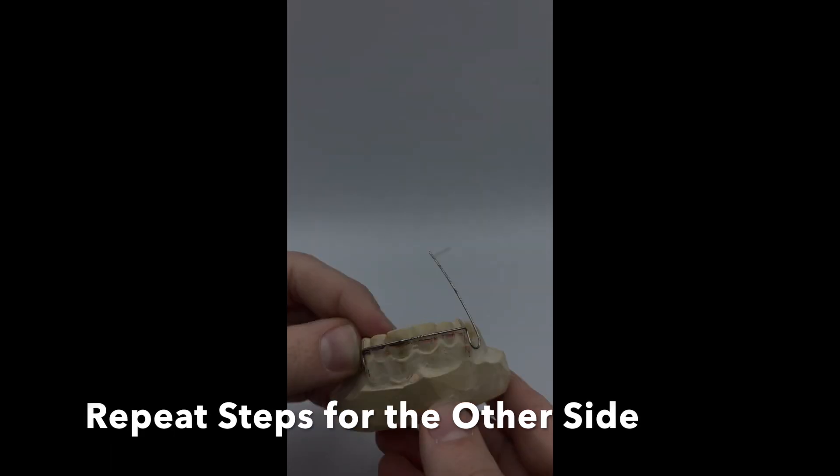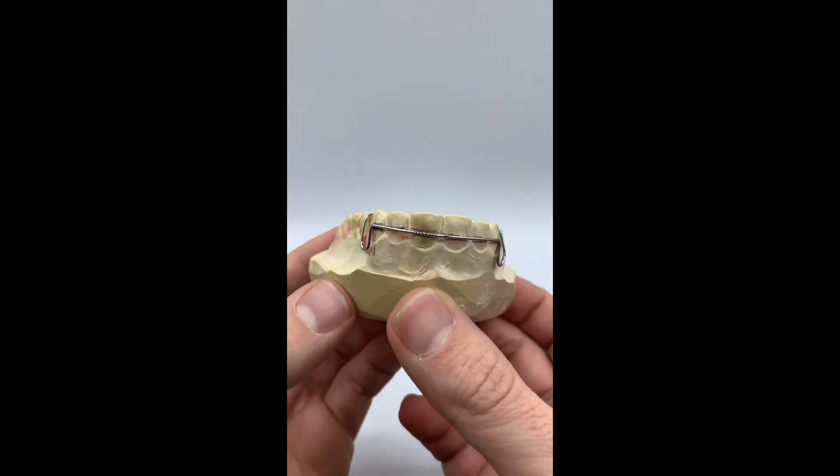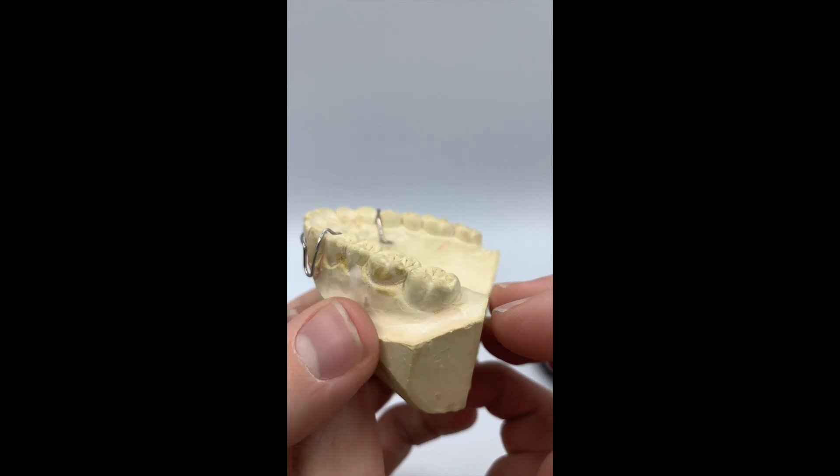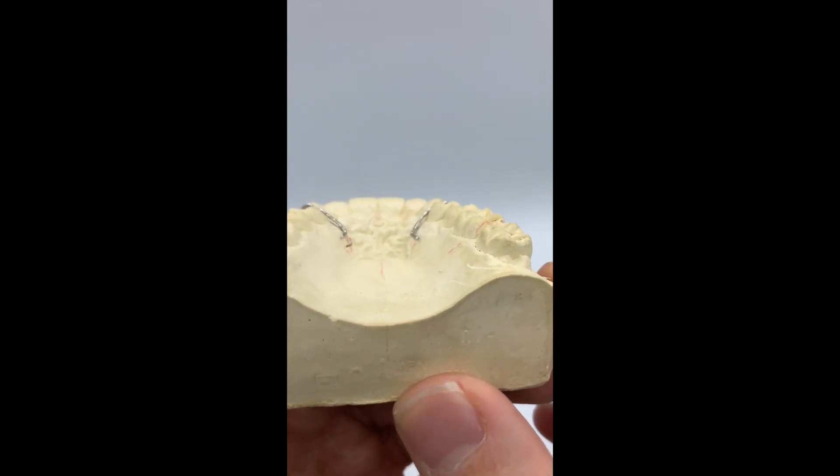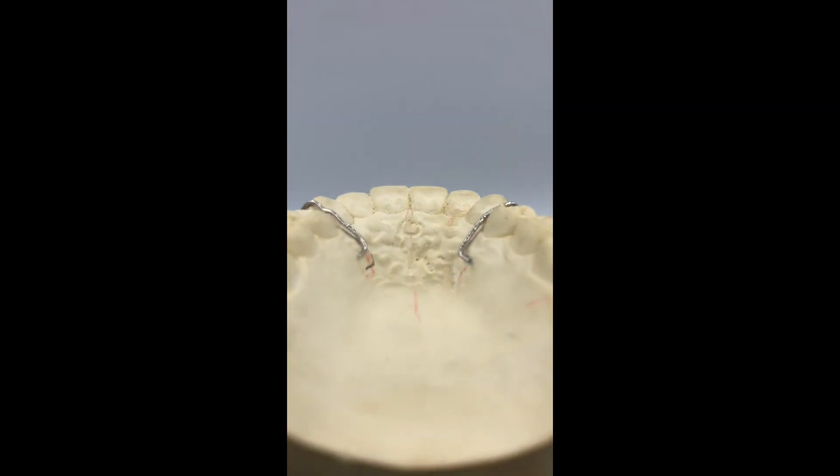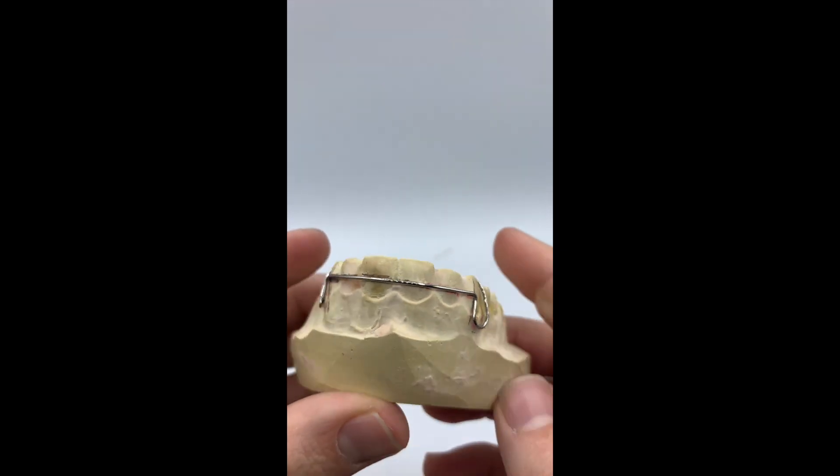Repeat the steps for the other side. Always looking back to the beginning, making sure your wire is straight and touching all teeth. A Hawley bow should fit passively with no pressure on any teeth.